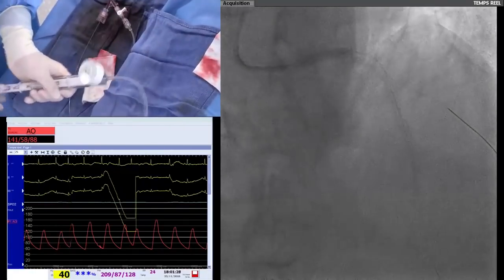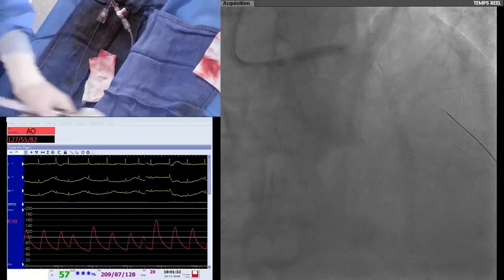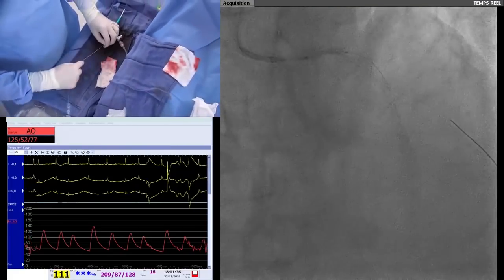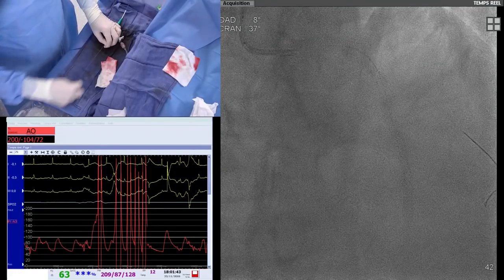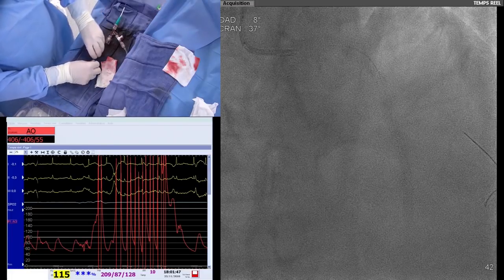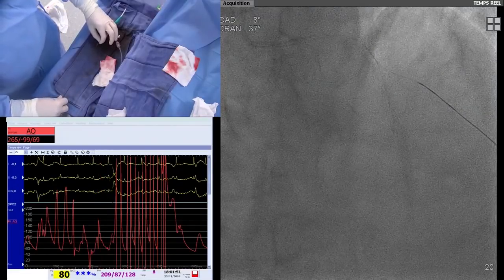20 atmosphere, 4mm balloon. We'll go fast because the pressure is going down, decreasing this time, and not because we are damping. So now I will remove the balloon. Is it a balloon of 3.5? 4 and 15. Okay. Non-compliant balloon, and I disengage also the guiding when I remove it.